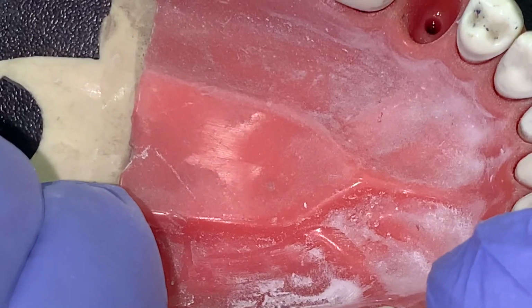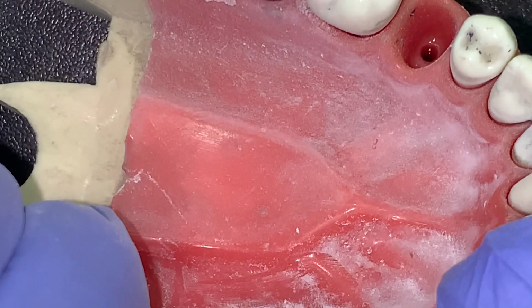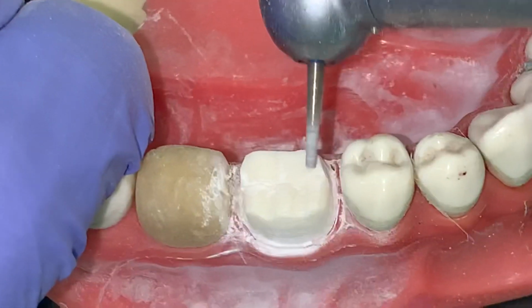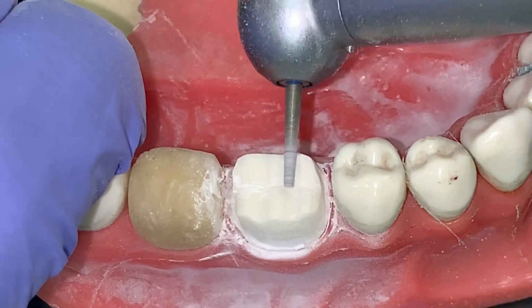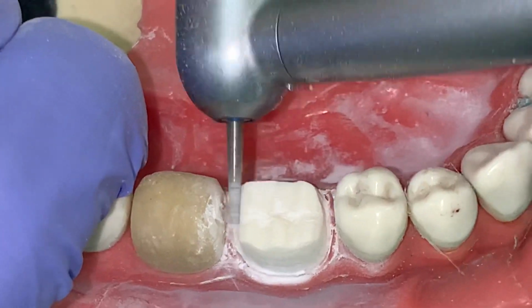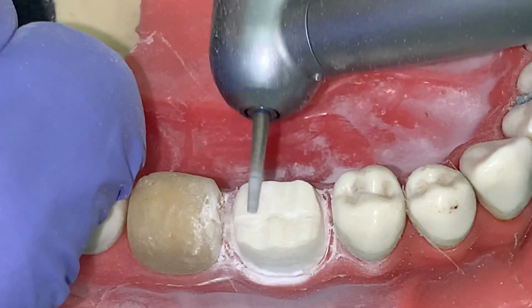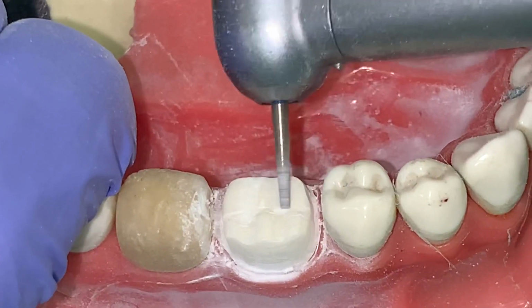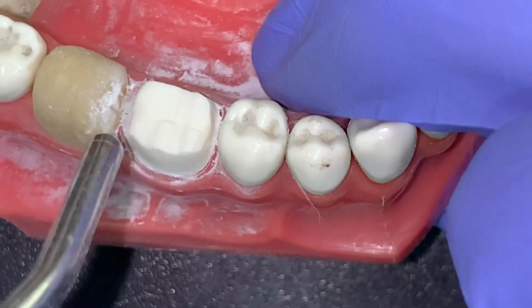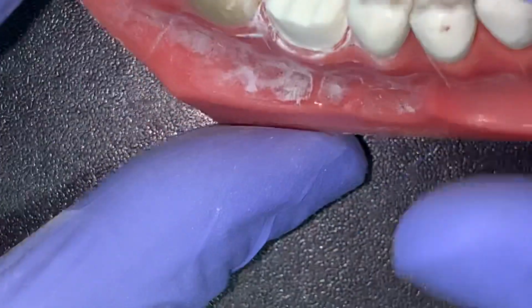So I was telling you that you have to avoid the undercuts, and number two, there should be no sharp line angles in your tooth preparation. So you can always use a finishing burr in the end, which I'll just demonstrate, to complete your preparation and avoid any sharp angles or any sharp surfaces. Now here the tooth preparation looks almost finished.